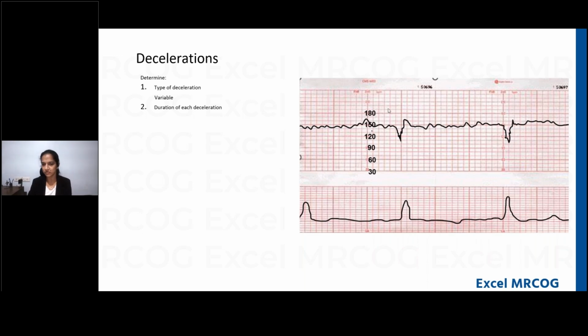So around 20, but it is going a little beyond that. So 20 to 30 seconds. Okay. So it depends. Now you know why the speed of CTG tracing is important, for you to know exactly the squares correspond to how much time. All right. Next.